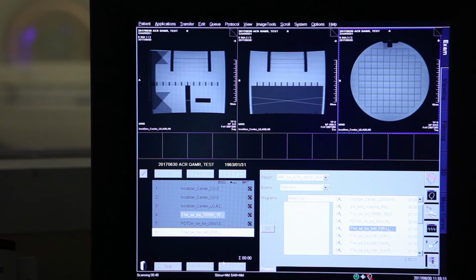How we image? Actually, in order to do it, yes, I understand. I got the drift. In order to visualize the homogeneity of the magnet in this case, you have to subtract the images. If you subtract the higher bandwidth from the lower bandwidth or vice versa, at the end you end up with something which is called a meniscal artifact or a meniscal sign. That's what we call it.